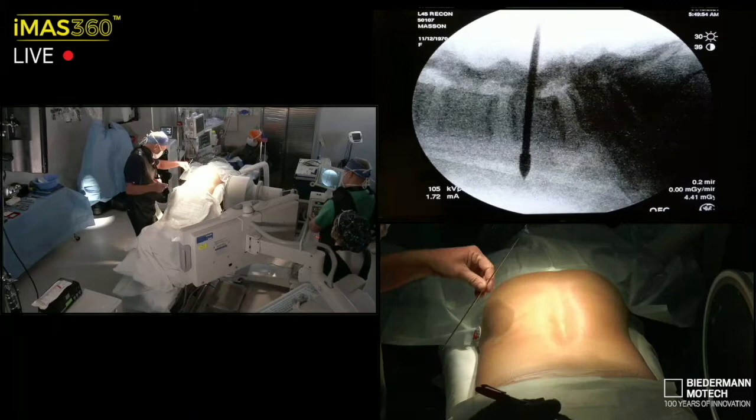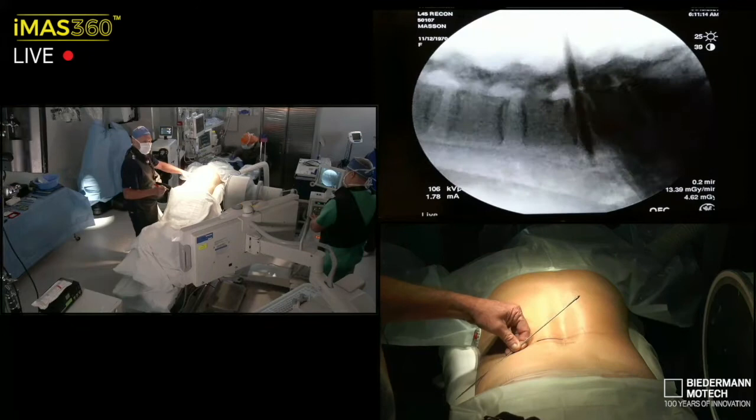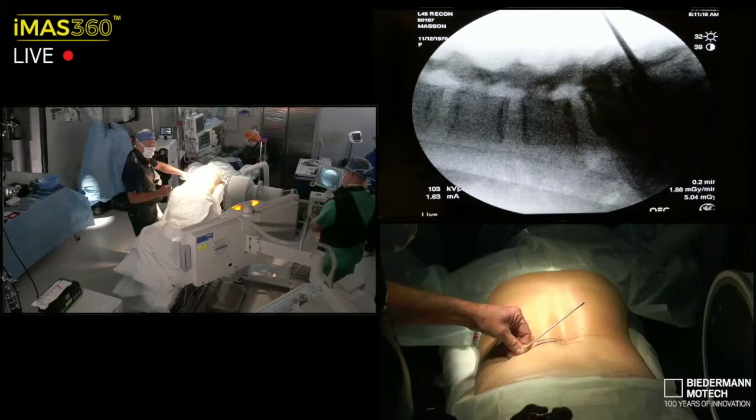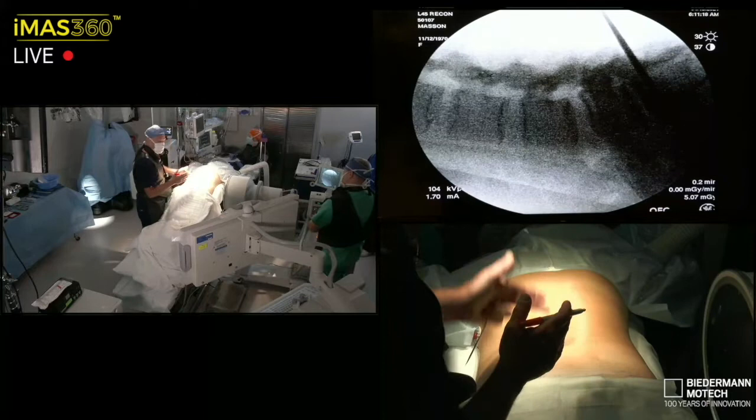So we're going to look at pedicle view L4 and mark a planar line, pedicle view L5, again a planar line. I want to go down to foraminotomy left L5-S1, so we'll make sure I've got a zone for that. Basically, I see the angle of attack, where the incision's going to be to get those angles for those screws parallel to the end plate.